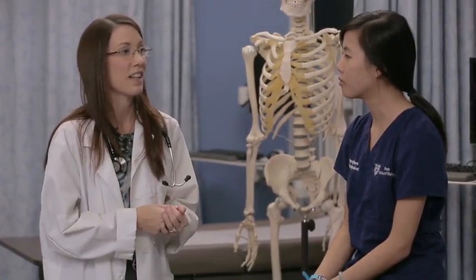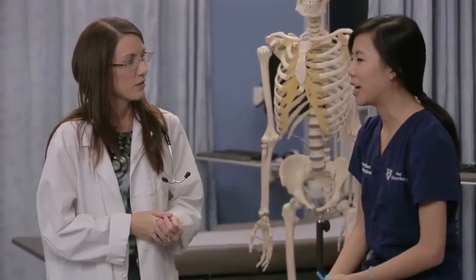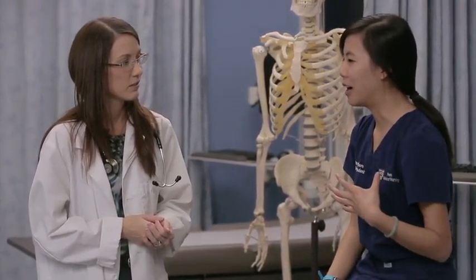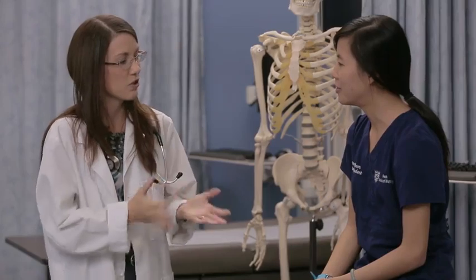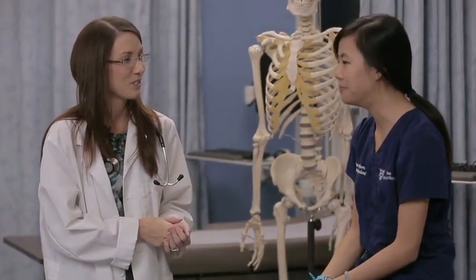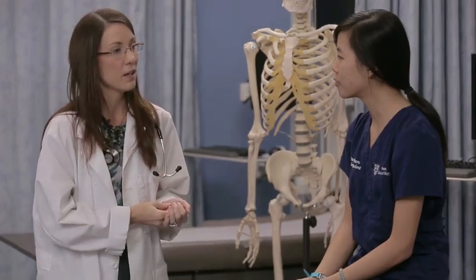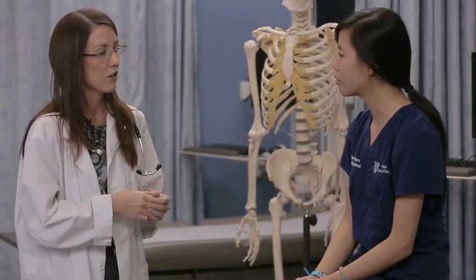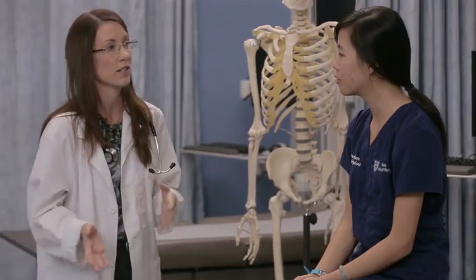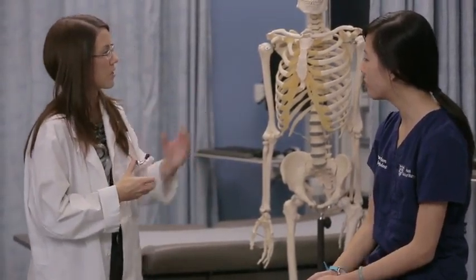S1 makes the 'lub' sound and S2 is the 'dup' sound that you should remember learning about with Dr. Skanga. Sometimes when lying on the left side, you can actually feel the heart against your chest wall — that is the point of maximal impulse. Auscultating is valuable because, in addition to S1 and S2, if somebody had abnormal heart sounds you would be able to hear them. Clinicians often listen in multiple locations, which is why understanding how the heart is positioned in the body is so important.